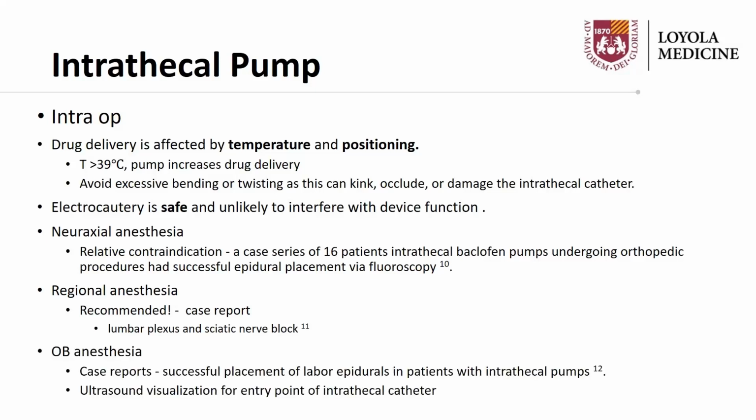For OB anesthesia, several case reports also describe successful placement of lumbar epidurals in patients with intrathecal pumps, provided the catheters can be placed caudal to the pump insertion site. And of course, interestingly, ultrasound can be used as a tool to locate the pump tubing prior to insertion.